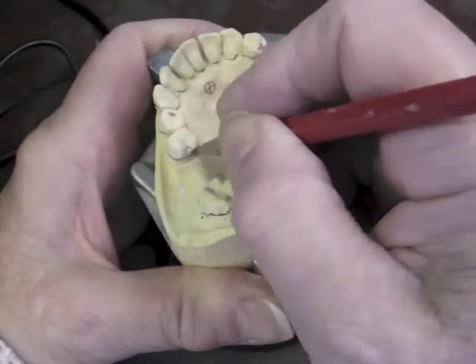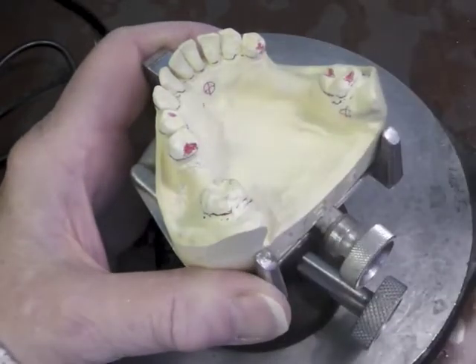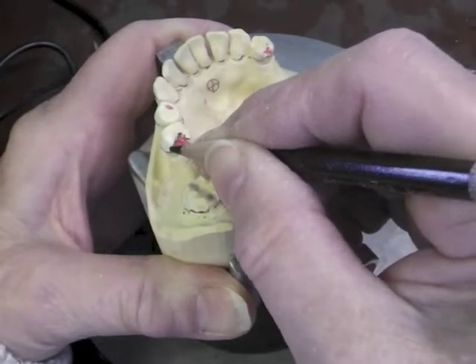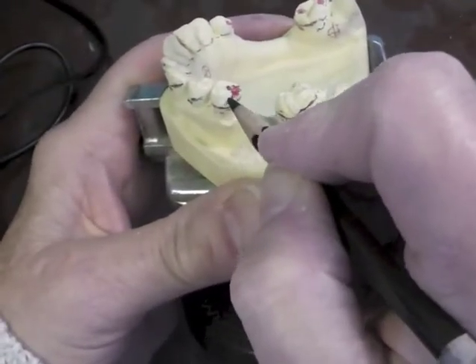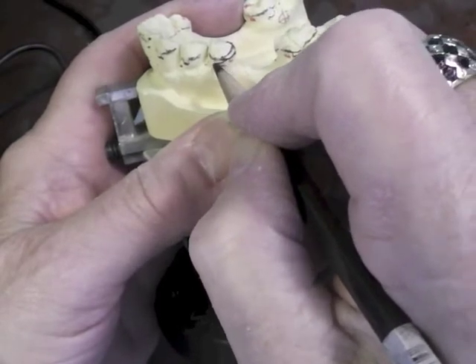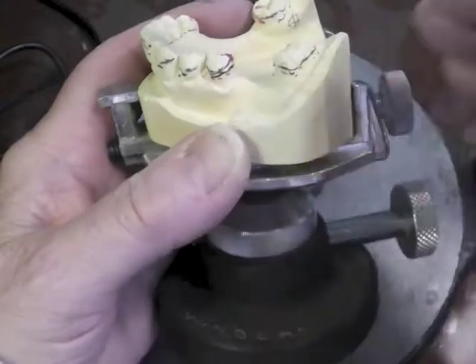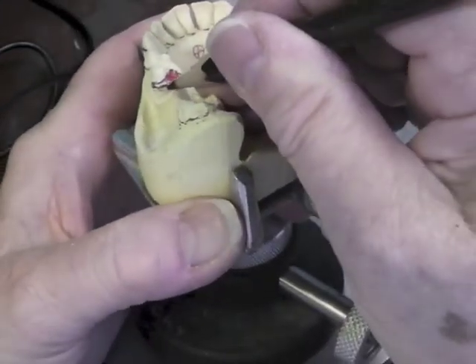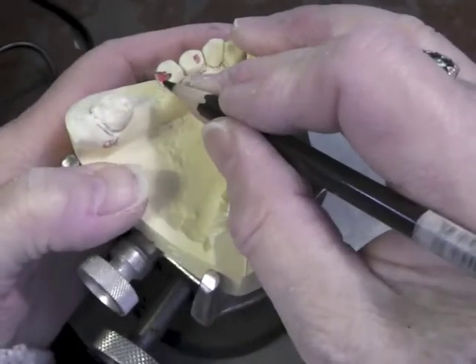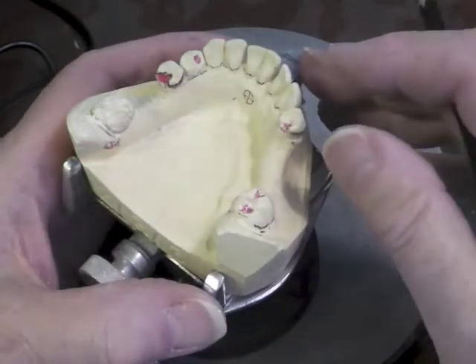We'll go ahead and draw this rest in red. I'm going to bring my metal — my framework — around that rest. I'm going to bring this arm; it has to be above the survey line in the first half to two-thirds, then I will bring it down to my 0.01 undercut and swing it back up a little bit — sort of a J-shape — that would be my arm. As the arm comes in this direction, it's going to form a guide plate right here. When I circle this rest in this direction, this will be my reciprocal component — it will be plating. The plating should be above the survey line, preferably in the middle third of the tooth.